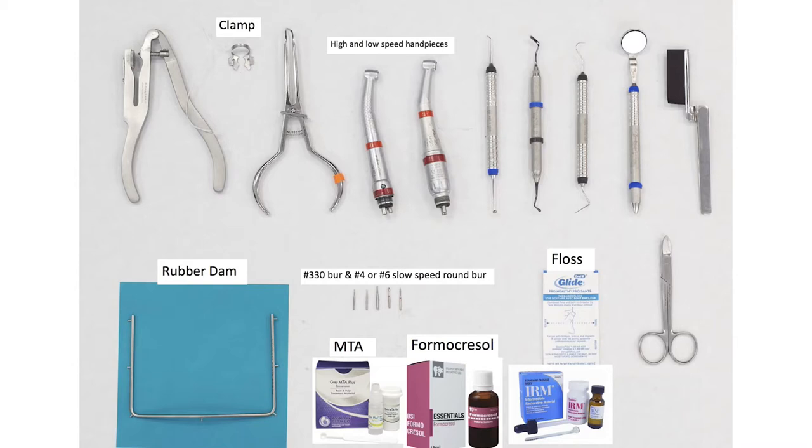The armamentarium includes the rubber dam, floss, high and low speed hand pieces, number 330 burr, a number 4 or number 6 slow speed round burr, formocresol, MTA, ZOE, or IRM.